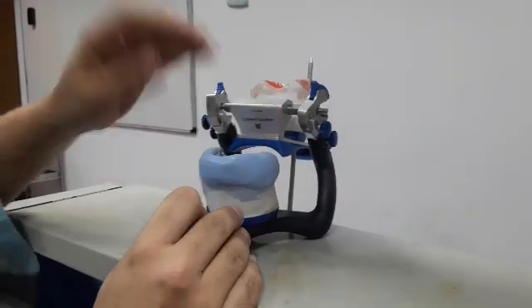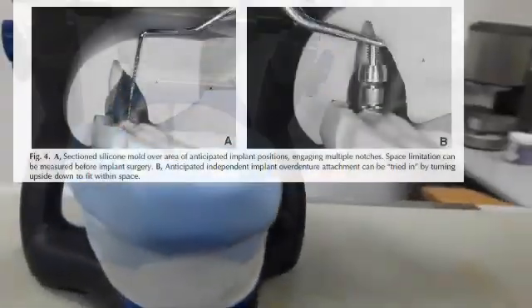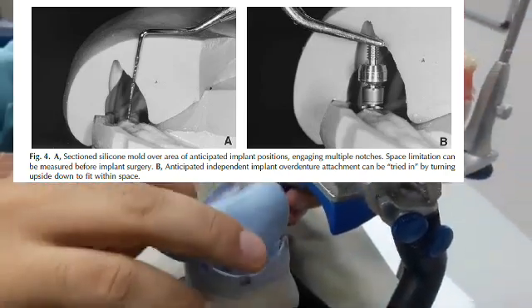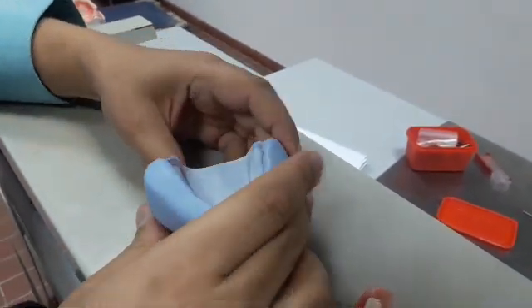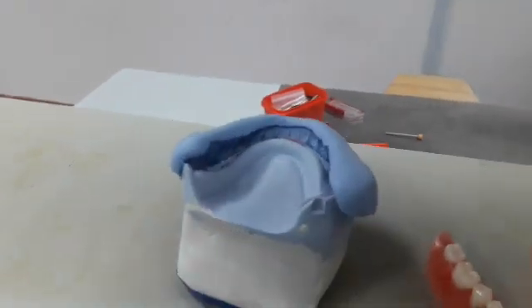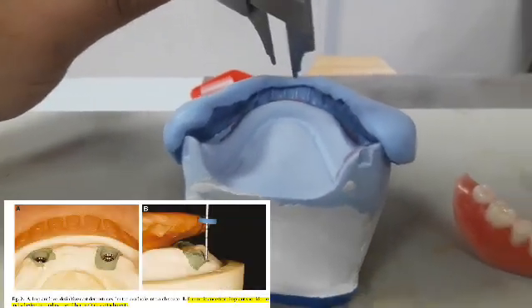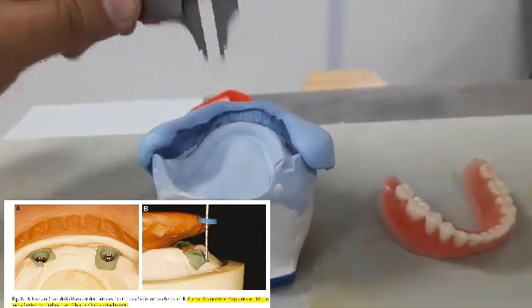We can also make an index — a rubber index or a silicon index, like this one. This rubber index will help me to assess the overdenture that is going to be made and the attachment that is going to be used. I remove this and place this. So I have here the available space to accommodate the attachments without being placed labially or excessively lingually, because I know where the teeth are going to be placed and the available space.